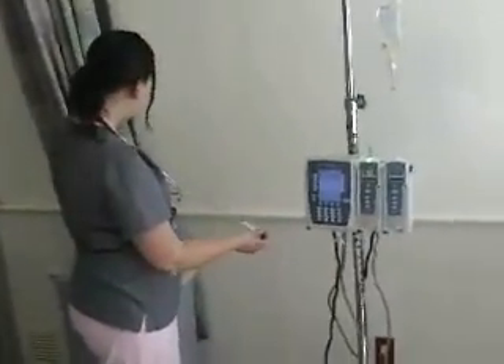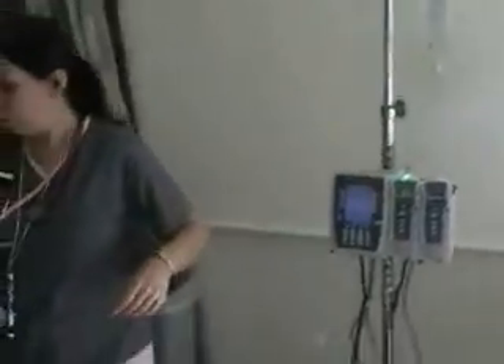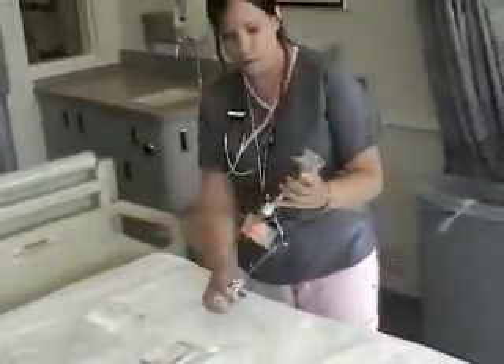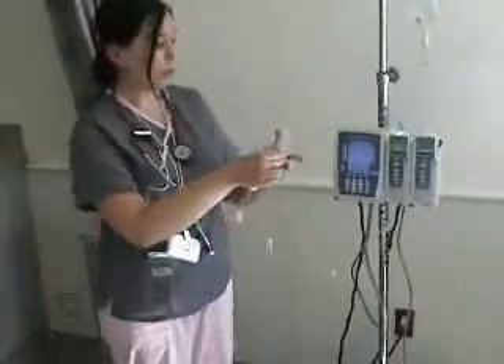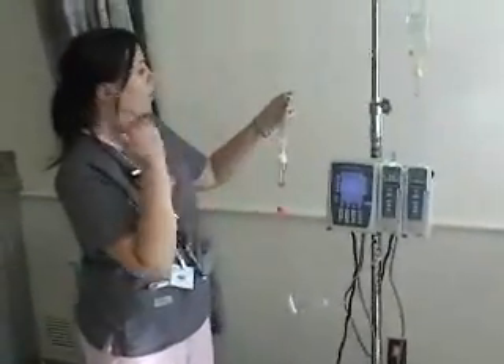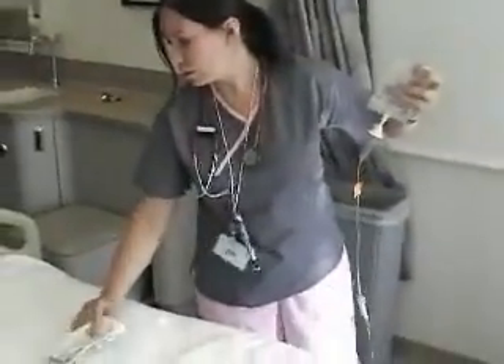What if the doctor orders a piggyback? If the doctor orders a piggyback, we can attach it onto what we have running here. Right here I have Levaquin — this is an antibiotic that we're going to hang along with the patient's normal IV.